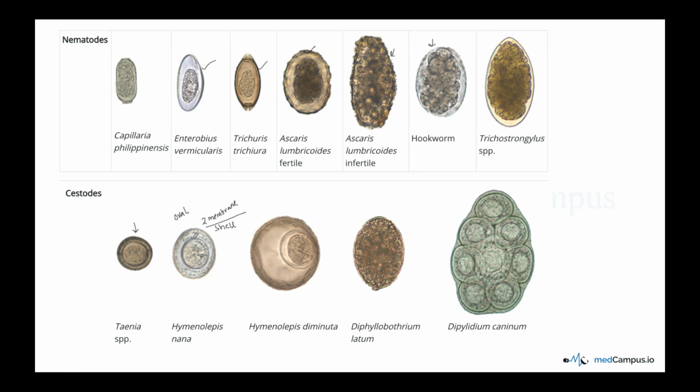One more thing is, in the inner membrane, as you can see, we have small knobs or poles, from which 4 to 8 filaments arise and spread out between the two membranes. Whatever I just described, the two membranes, knob, pole, and filaments arising from it, is not clearly seen here.